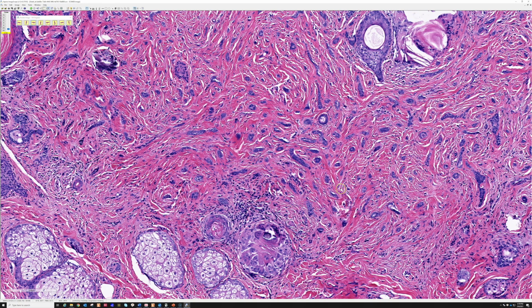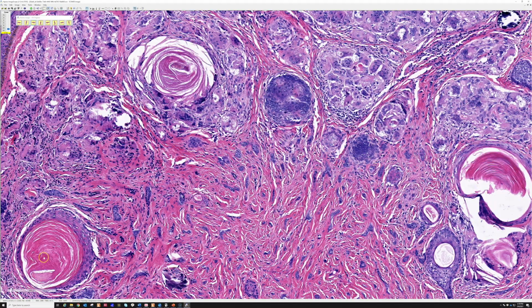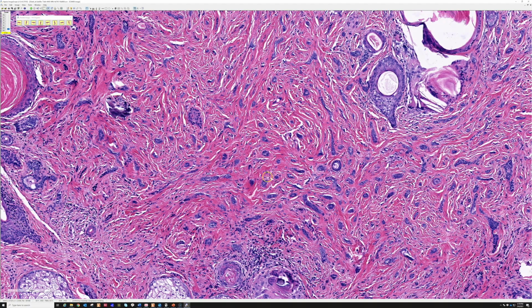As you might have thought, this is a type of hair follicle tumor, whereas MAC is a type of sweat gland tumor. So MAC should have sweat duct differentiation. You should see obvious ducts, and desmoplastic trichoepithelioma should not. That sounds like it should be easy, but in practice it's quite hard, because with MAC, oftentimes on the superficial aspect you get keratin microcysts and very compressed little strands. And if there's a duct, it's very difficult to see the lumen of the duct.